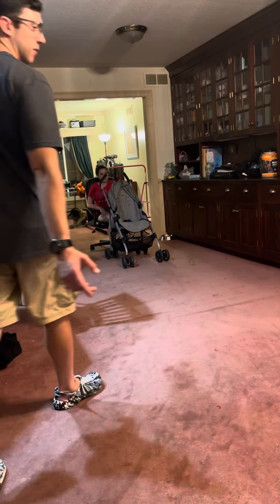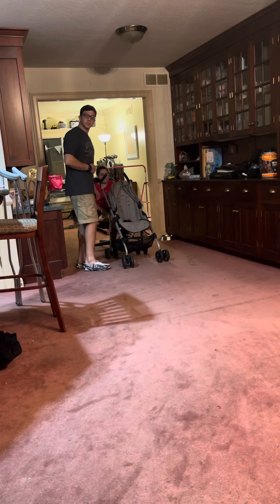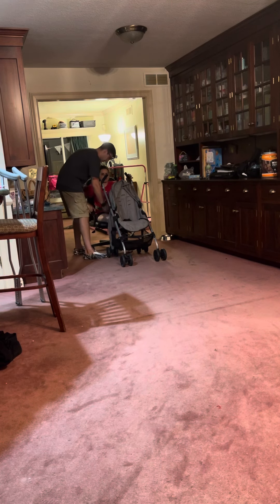All right, now we have three-point modified with toe touch weight bearing status. Scoot this walker nice and close. Go ahead and scoot to the edge of the chair for me. Wheels are locked in place. Weight belt or gait belt is nice and snug.